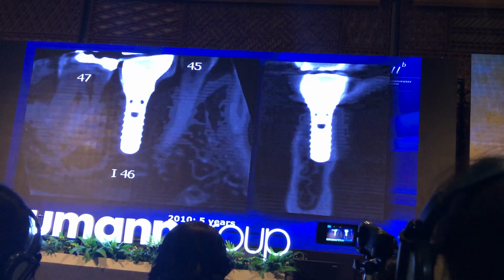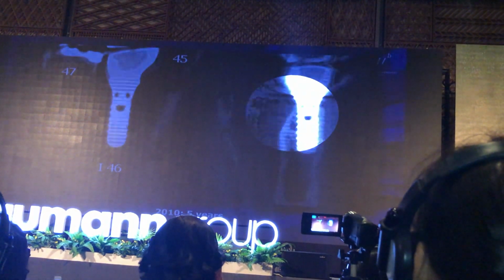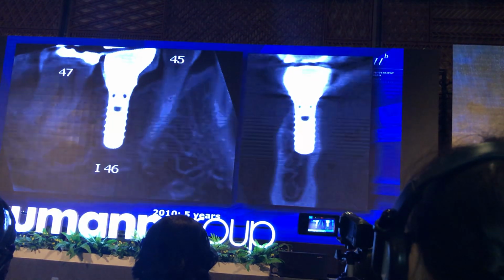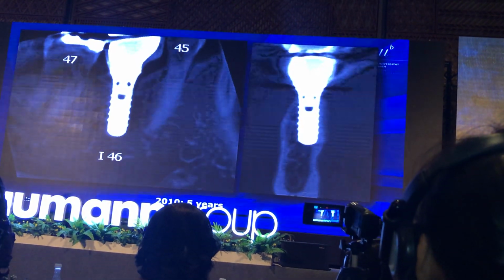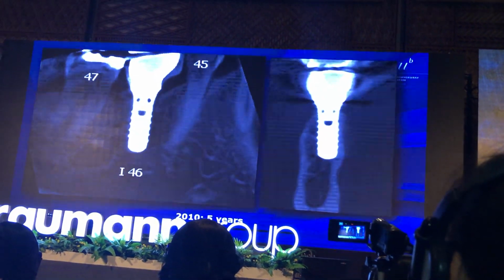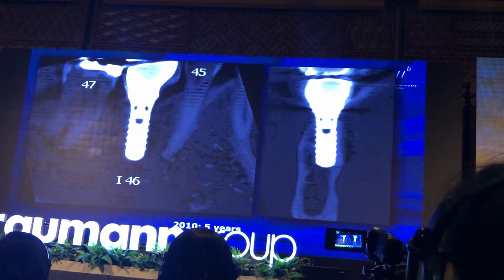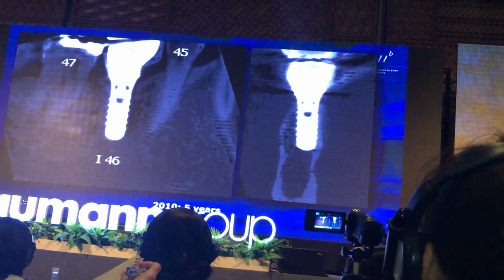So that is the implant. You see, it's a very happy implant. It's a smiling face. And look at the buccal plate. The buccal plate is fully intact. And you remember how much defect we had. And you remember we had a balcony type defect to stabilize the bone grafts, so they cannot glide down. Okay, so this is a quite interesting implant.